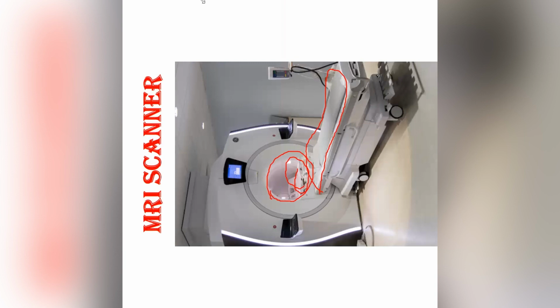That's why people are advised not to go inside an MRI machine room if they have any metallic implant which is ferrous, which is metallic, iron based. So this is the MRI scanner.